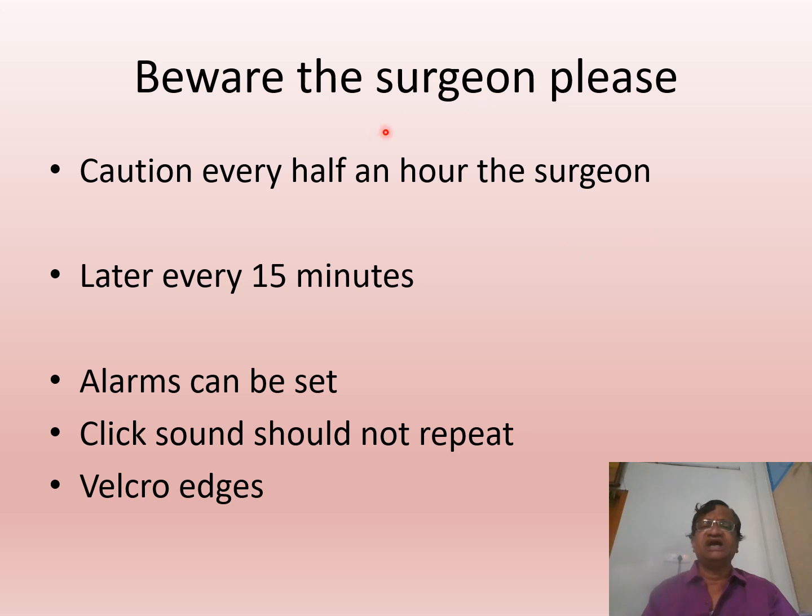Caution the surgeon every half an hour. Now we have got automatic alarms. As soon as it is inflated and kept inflated, 1 hour later, pam, pam, pam, it will alarm. But if you are not having these things, caution the surgeon, 45 minutes is over.